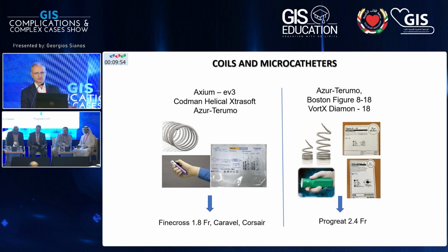So these are the very basic principles, for something that doesn't happen very often, but when it happens, there are no other solutions. Of course, not no other, because you can inject fat through microcatheters, you can inject microspheres. There are other things that you can do, but certainly you have to be familiar with coils and how to use them.